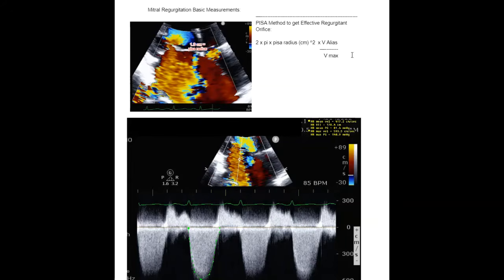One thing I encourage my fellows to think about is using units and putting them in your calculations and doing the calculations longhand. Don't shortcut yourself. Using unit analysis is a great way, when you're taking your test or in everyday life, to make sure you have the correct formula and you're doing the calculations correctly. Whenever you can, in most circumstances, change all your units to centimeters per second. You don't want to be mixing any millimeters or meters in because that will really mess up your measurements.